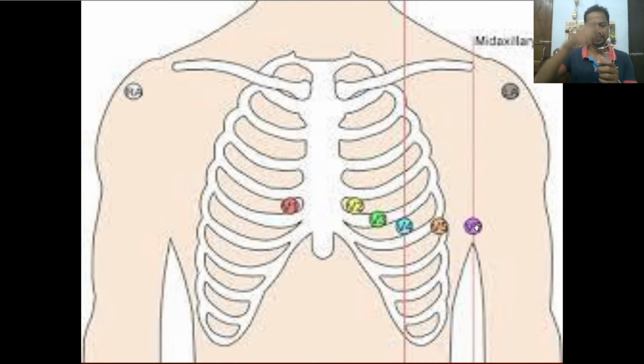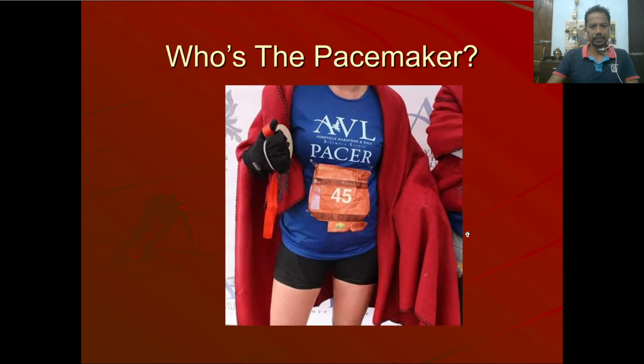Okay, so these are 6. Usually on the machine, on the electrodes, you will see the leads hanging like this, and there are different colors allotted, violet, indigo, blue, green, yellow, orange, red, like that, which usually follow a pattern. Then there are other leads. Okay, so we will come to the leads later on.